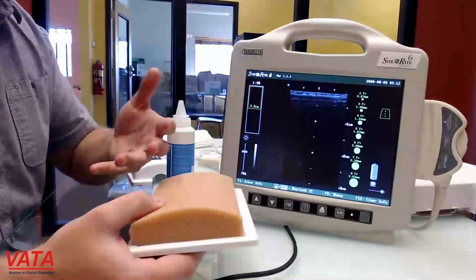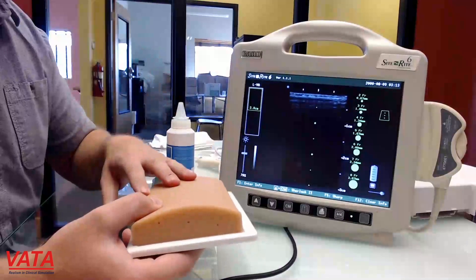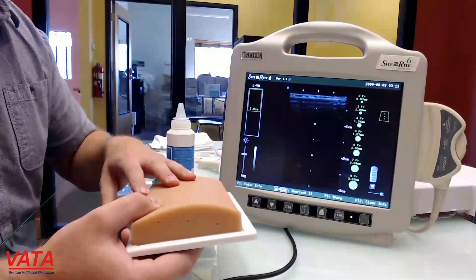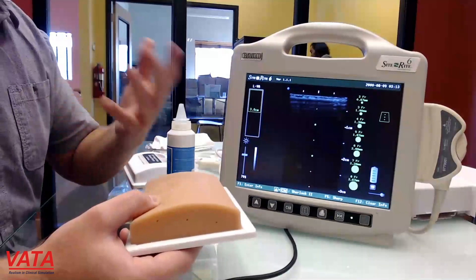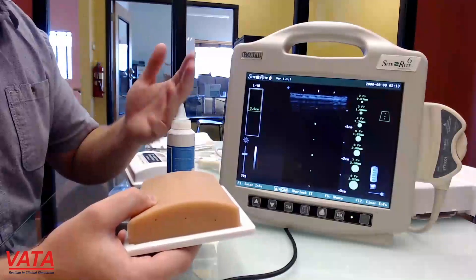We know a lot of medical reps that use this one for their sales jobs, and they're able to use one of these for about a year. They're using it three to five days a week, where most people are going to use it maybe that many times per month.